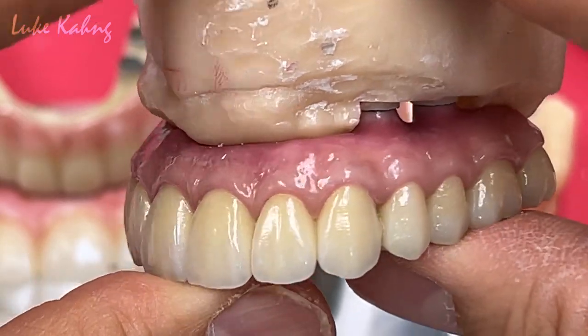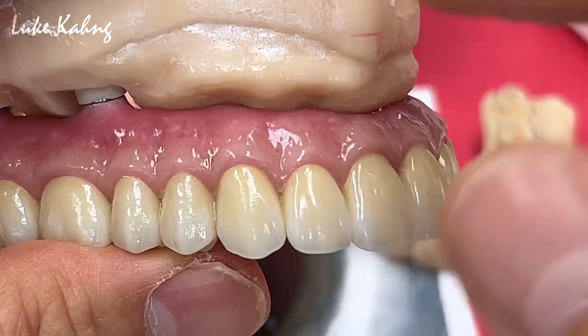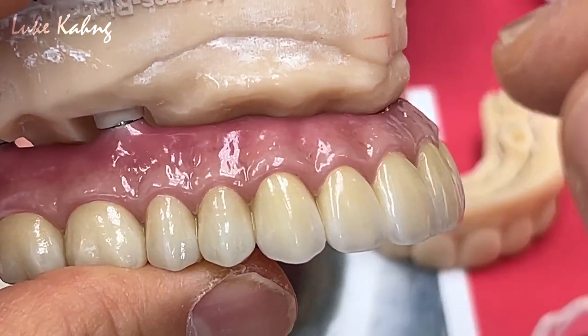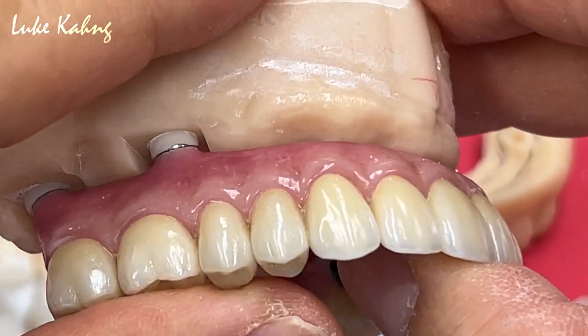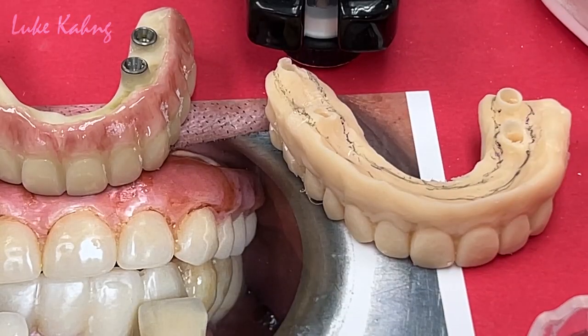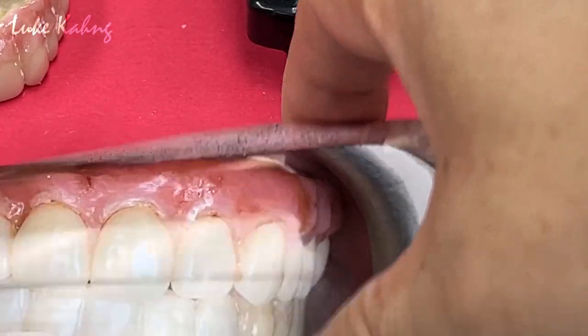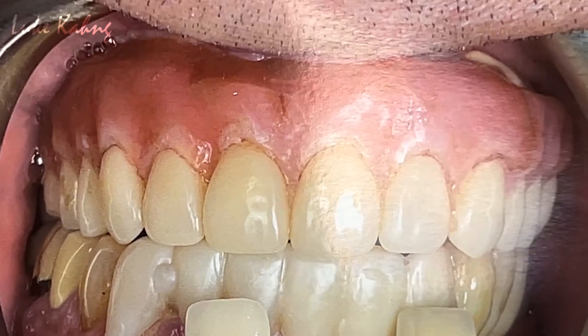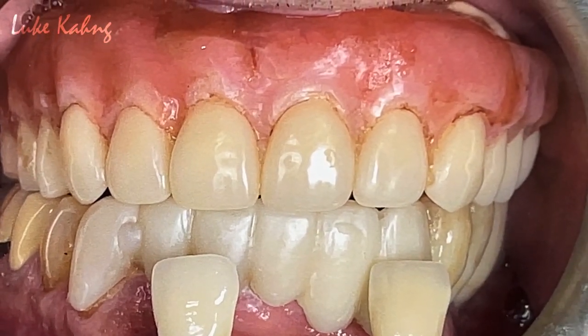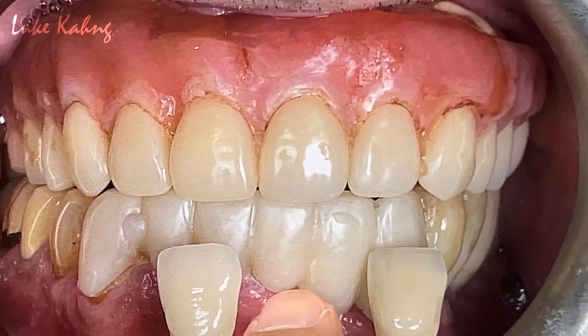This is the finals — full mouth restoration. Here's the story for this patient: they had previous nice dentures. That one is our guideline — the shape, contour, and design was there. Looks like it is temporary to me. So this is what we build it. Doctor sent to us the contour from the STL file, so we printed a model from the STL. And maybe another PMMA which is provisional — you saw that in the other video — with the exceptional contours.